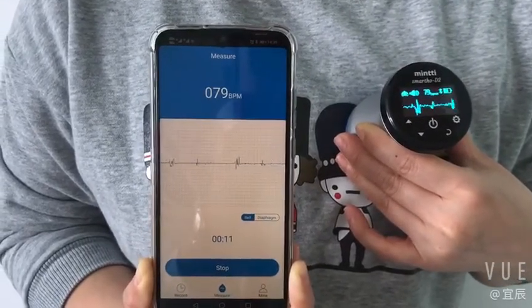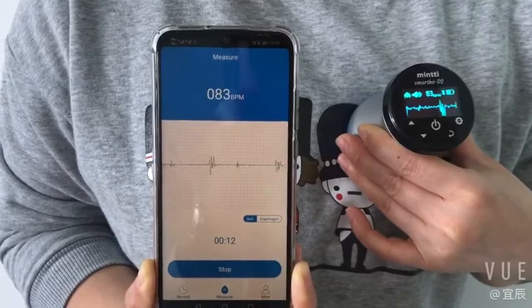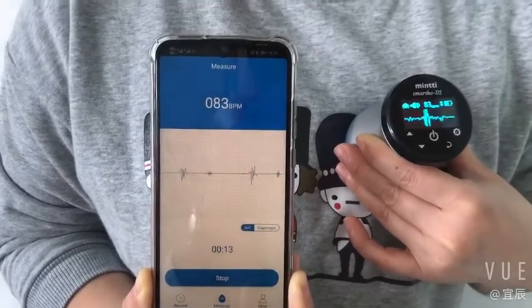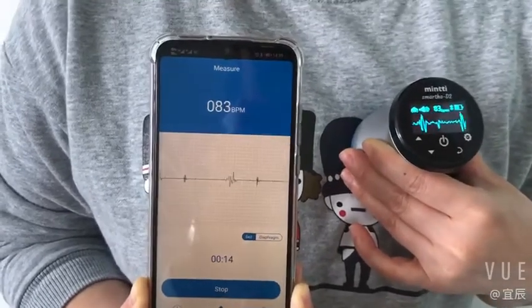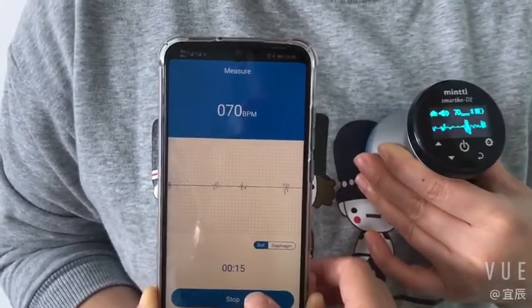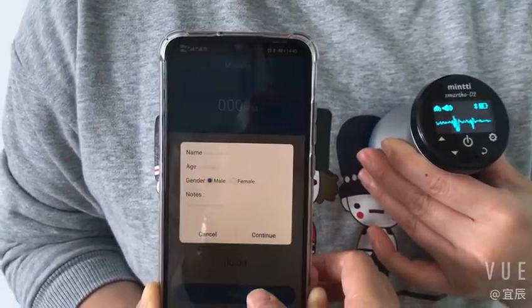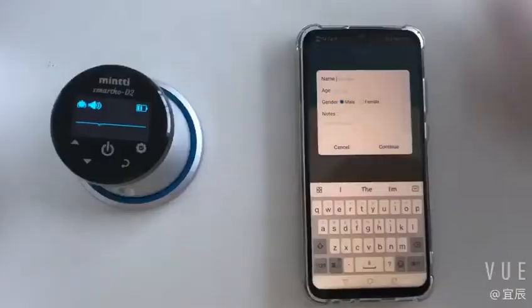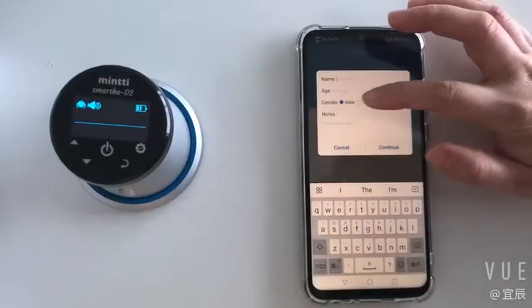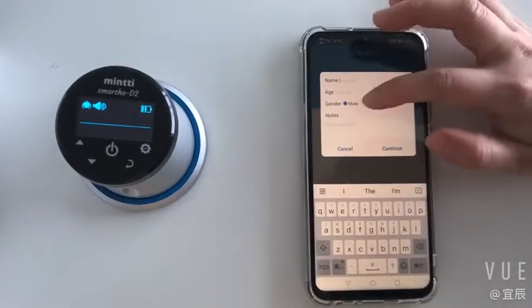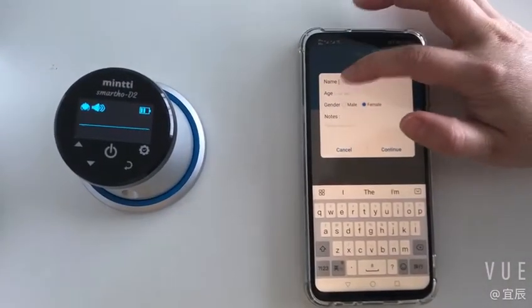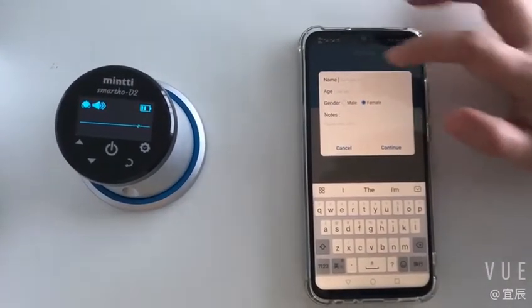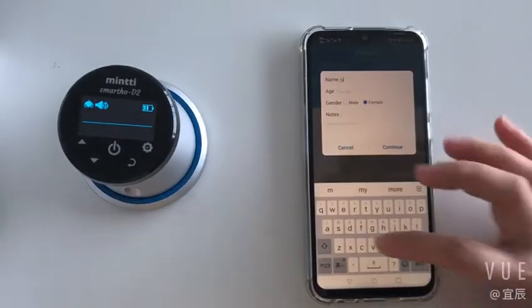When connecting the device for the first time, you need to bind the device. After the connection is done successfully, it will automatically jump to the measurement interface.